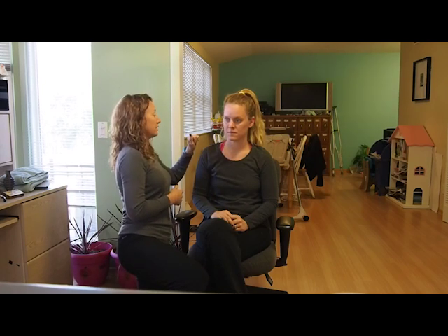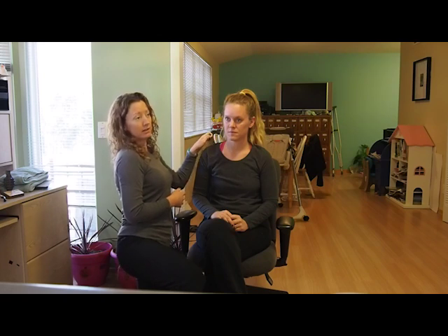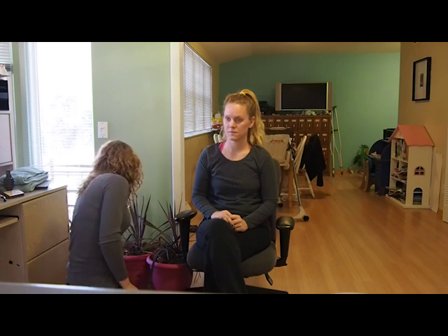Then to test the air, the auditory conduction, same thing with the tuning fork, but just hold it right next to their ear, not touching anything, and see what the difference is in the amount of time that they can hear. Normal would be that you would hear the air conduction twice as long as you would hear the bone conduction.